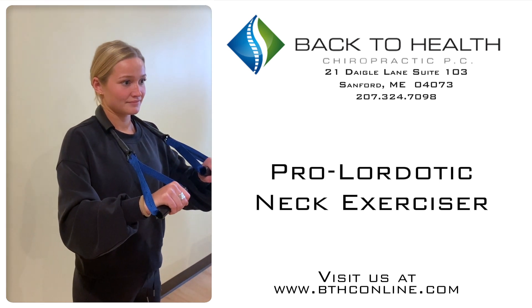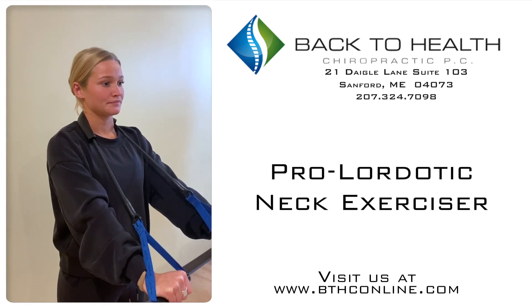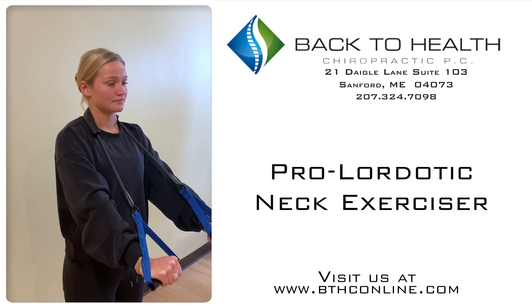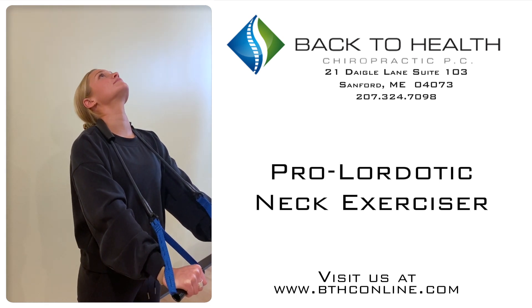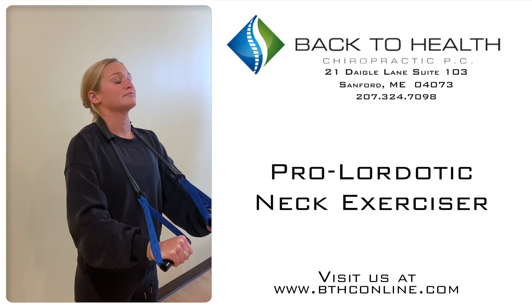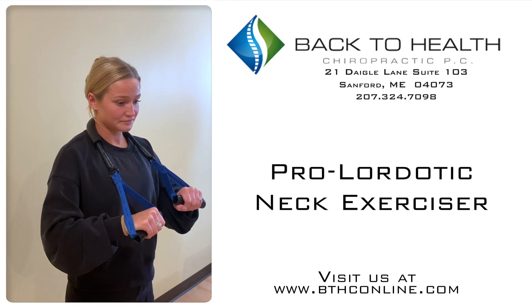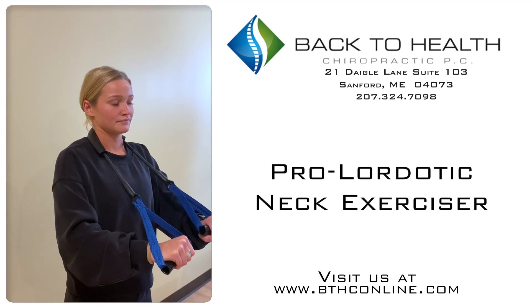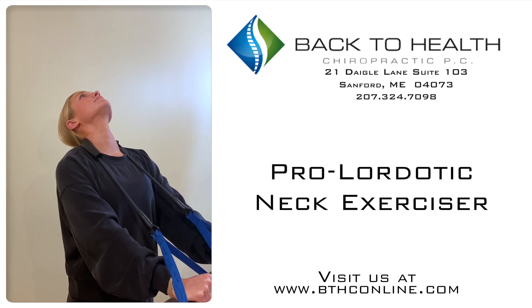We're going to start with position number one. We're going to extend arms in about a 45-degree down position from horizontal and then extend the neck fully back. We'll hold that for a few seconds and then rest arms and neck at the same time. At home, you would do 10 repetitions — we'll just do three or four — where we extend the arms and the neck at the same time as a pumping action.